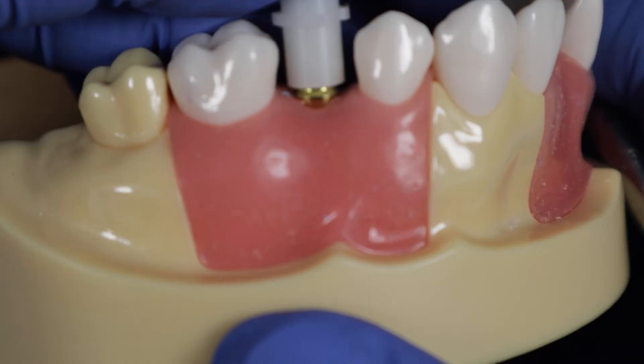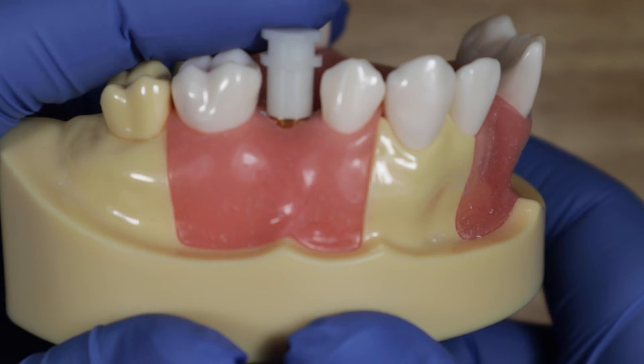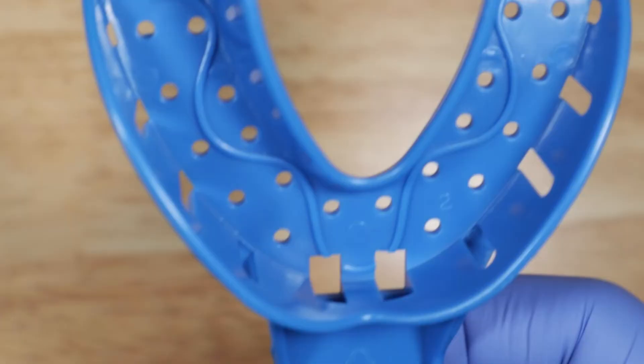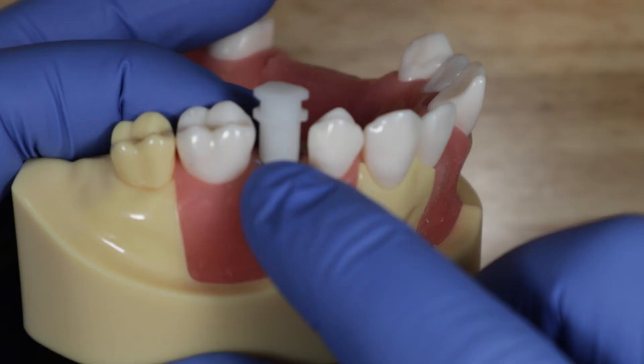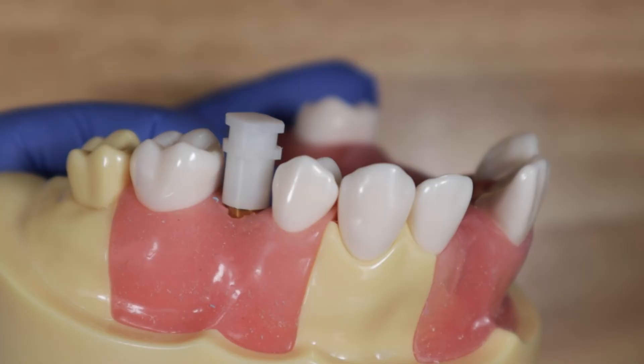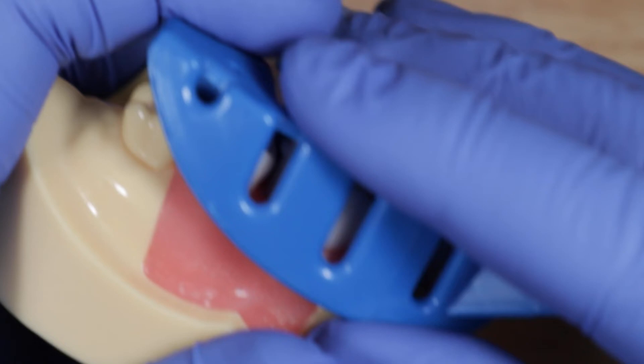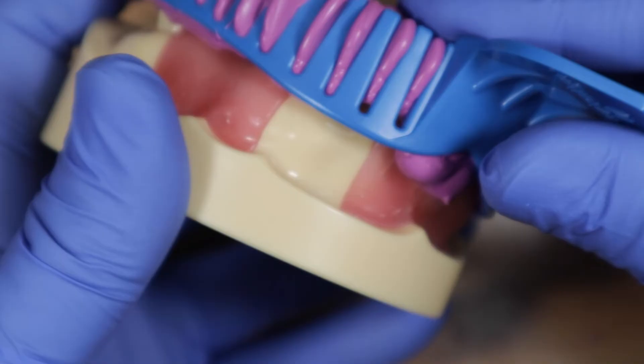Make sure it's completely seated — that way your occlusion will be correct on your implant crown. While your assistant loads the impression tray with heavy body impression material, express light body all around the coping: buccal, lingual, interproximal, and occlusal aspects, and get some into that retentive feature. Once the tray is loaded, seat it all the way down — no need to cut or modify the tray. Just seat it and let it set.